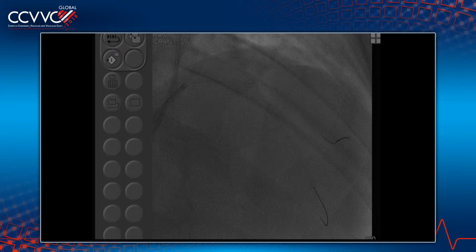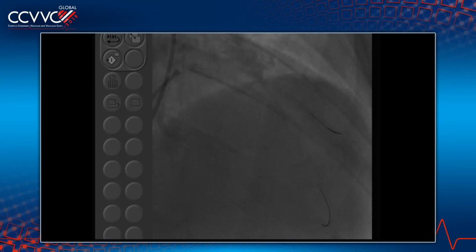I think as you see, the DK crush has a lot of comparison, but mostly with the provisional stent technique, which has never been compared to mini crush technique. High volume operators, if you ask would you go for DK crush versus mini crush, would definitely prefer mini crush since the steps are fewer, less steps, simple, and done faster.